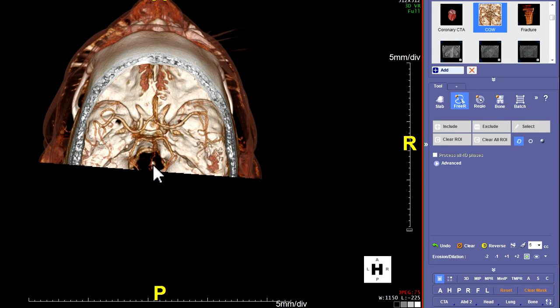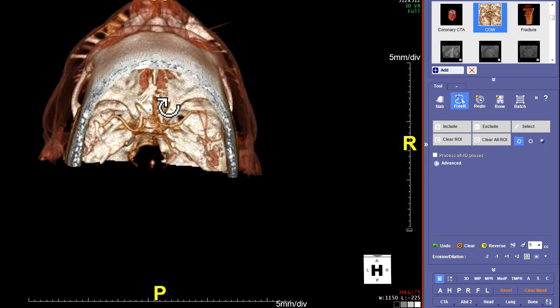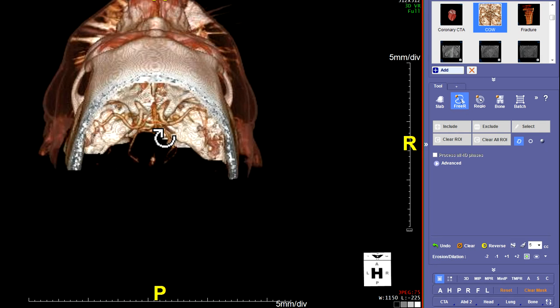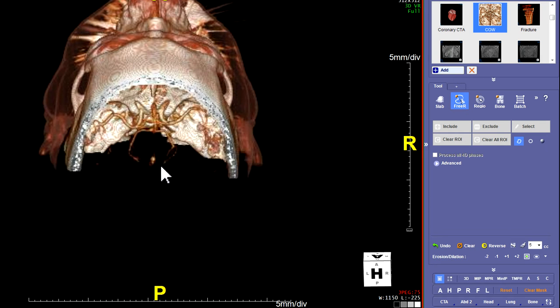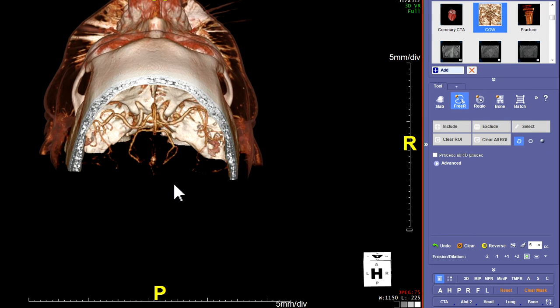Now we're going to scoop out the veins — do the gut cut. Be sure that you're on rotate, then go up here, left click and pull it back. Line it up so you can see those veins in between the posterior cerebral arteries, and then scoop out the veins between the posterior cerebral arteries.